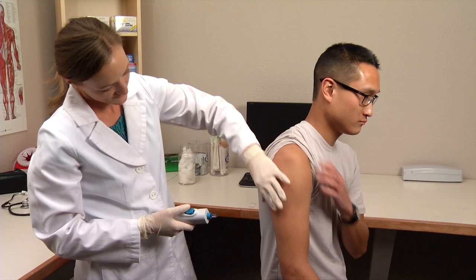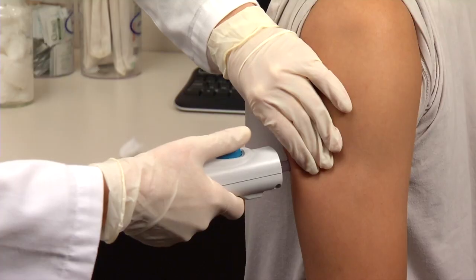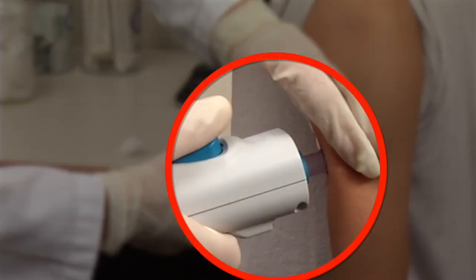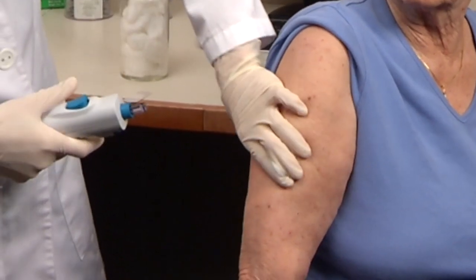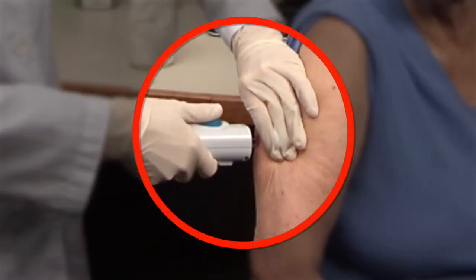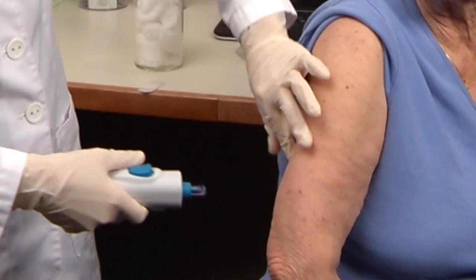Remove your thumb from the multifunction button and engage the patient by pushing the syringe against the injection site at a 90-degree angle. Apply gentle pressure until the blue retractable ring is fully depressed. Depressing the ring fully releases the safety and allows you to now press down on the multifunction button to inject, while maintaining a steady pressure against the injection site. A click will be heard upon injection.